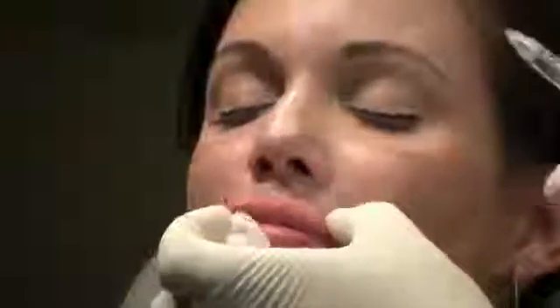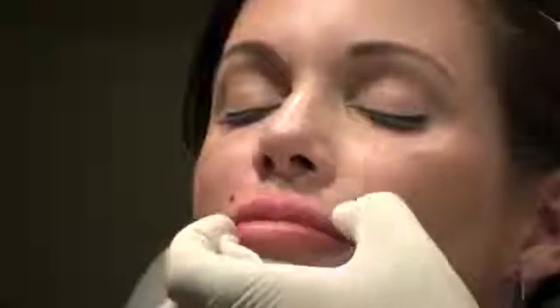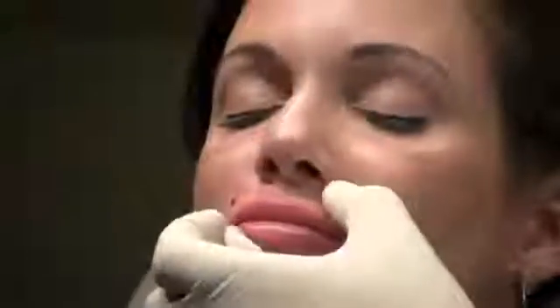Do the same thing on this side. She doesn't need to lower down. After I inject it, I massage it, smooth it out. And as I feel it right now, there's absolutely no lumpy bumpiness. And that's the beauty of Juvéderm. So that concludes the injection of Juvéderm Ultra to the lips and the nasolabial folds.